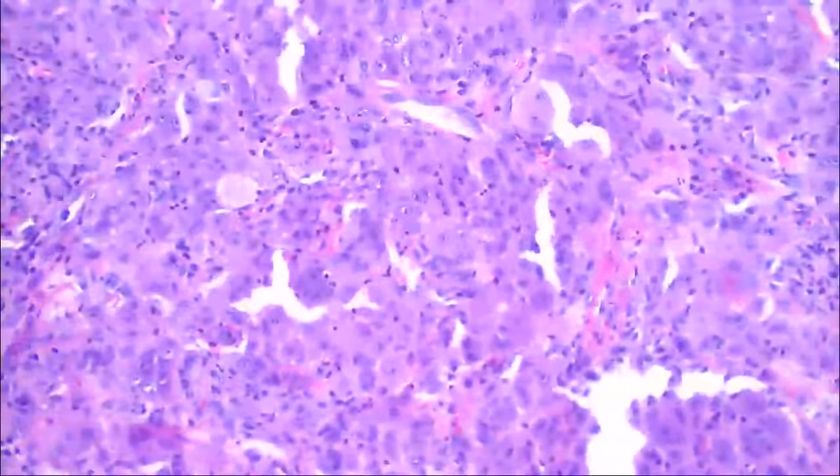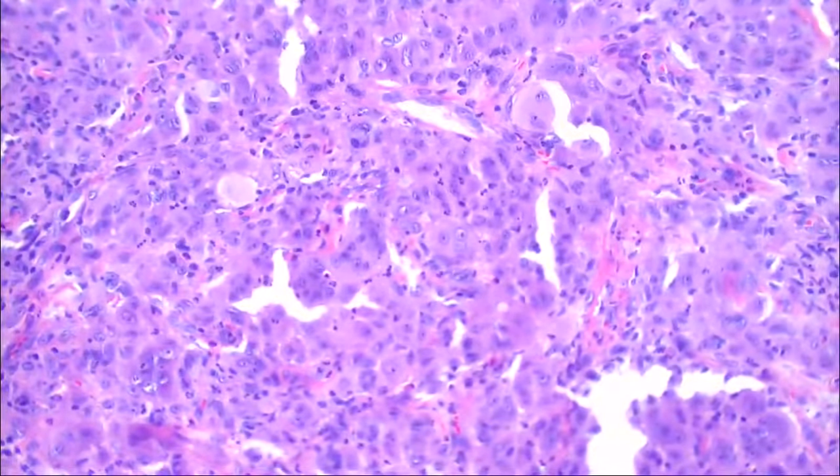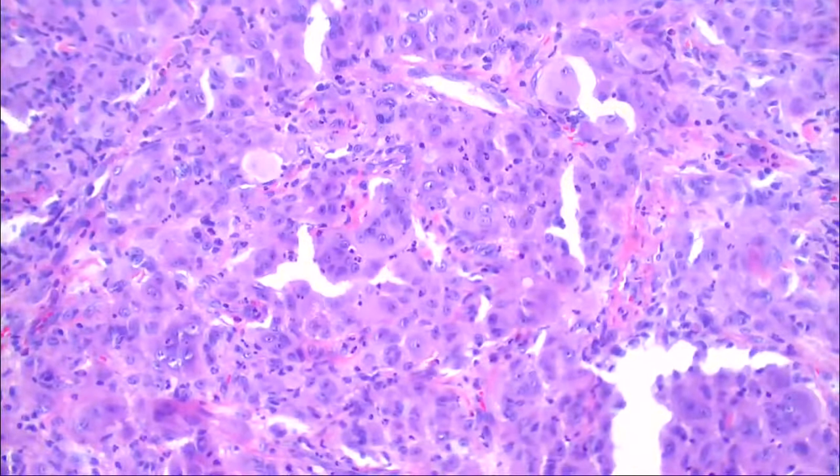Some people say if it's just a solitary lesion, it's probably just a variant of an XG. If there are multiple lesions, then you think about reticulohistiocytoma. It's sort of whether you're a splitter or a lumper, it doesn't really make that much difference. The main thing is just to make sure that you're not missing anything systemic. Generally, if it's reticulohistiocytoma, they don't get that inflammatory infiltrate. That is more commonly seen with an XG in the inflammatory stage.